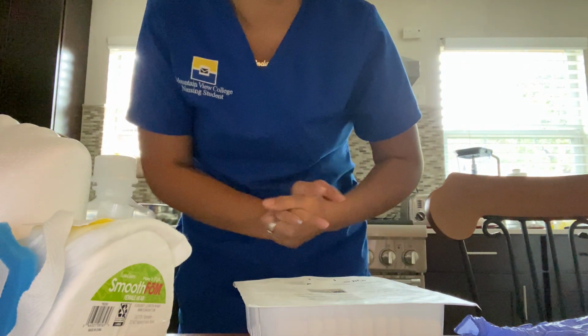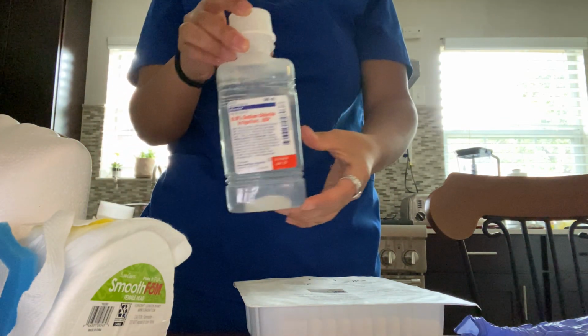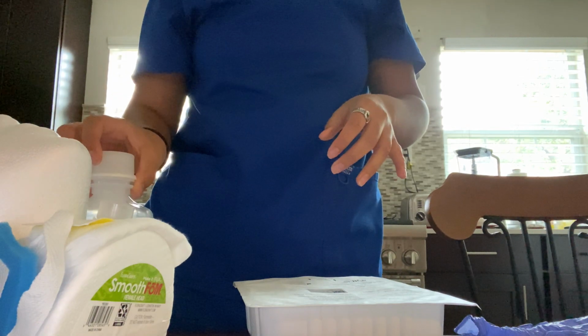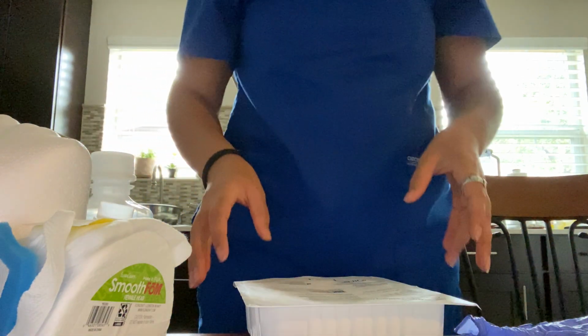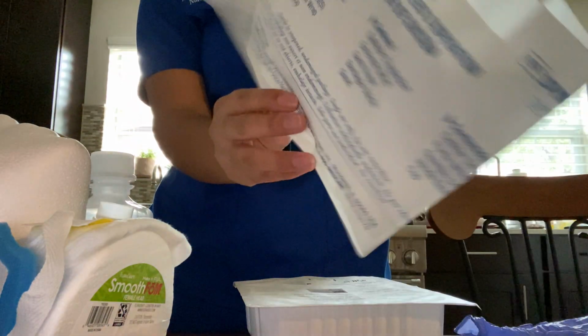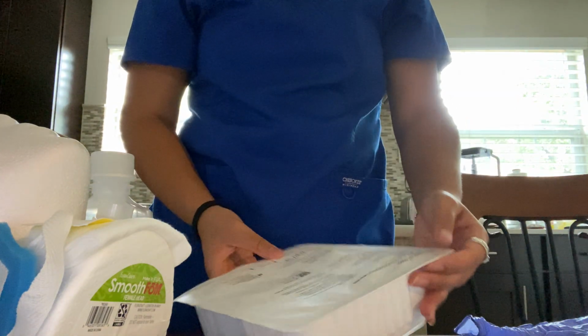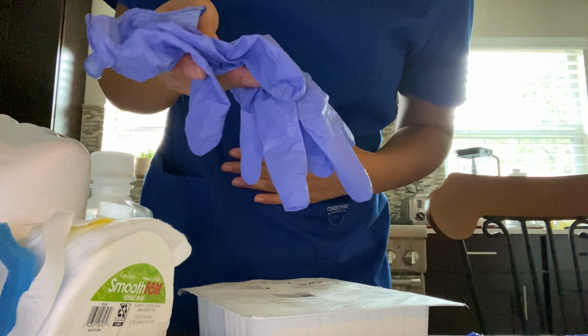We're going to gather our supplies. So we have our normal saline, here it is. And then we have our suction kit. Here we go, we have our tracheostomy care kit. And then we have our gloves.